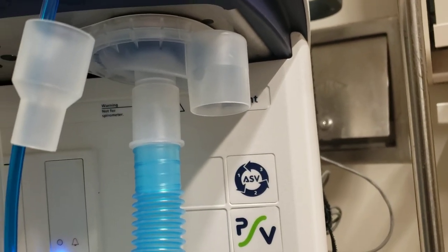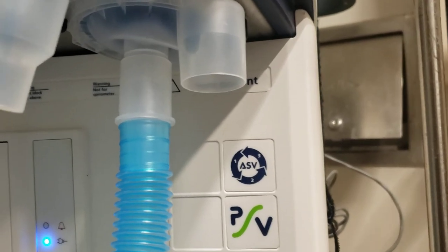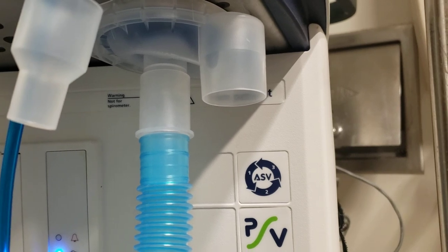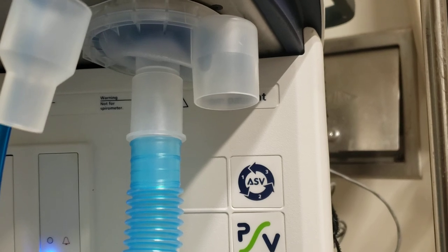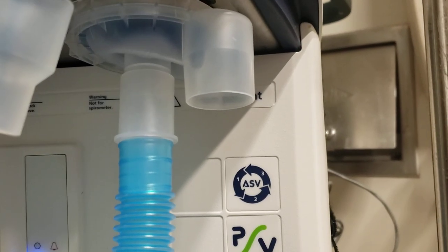This is Justin Seemuller, Respiratory Clinical Specialist for Centera Norfolk General Hospital. With some potential shortages of expiratory viral filters for ventilators, we are looking at alternative options to keep the staff safe and prevent the aerosolized particles from potentially entering the room.